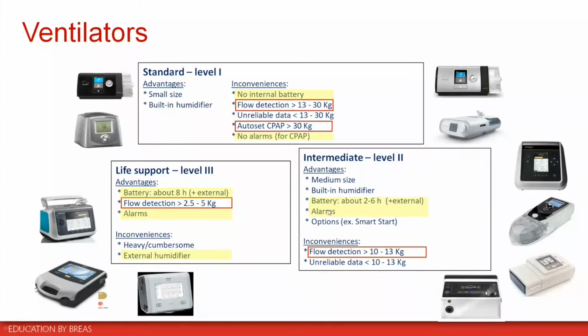This varies a lot. These level 2 ventilators can all do CPAP, but it will be constant CPAP, and obviously these are already considered NIV ventilators. They have some options, depending on the manufacturer and the model of the ventilator, and you will have different kinds of options.